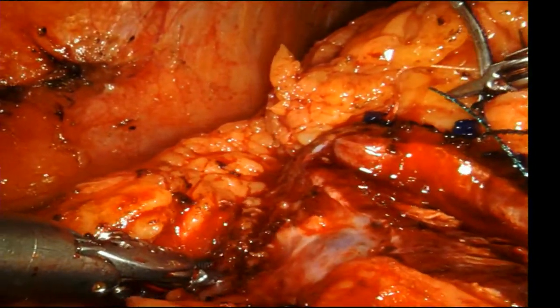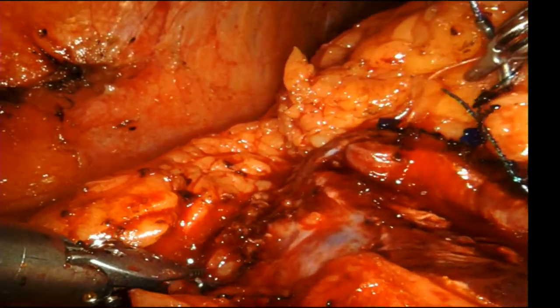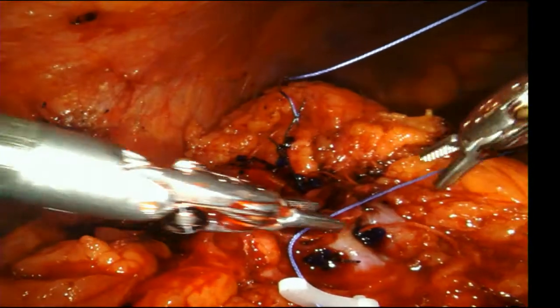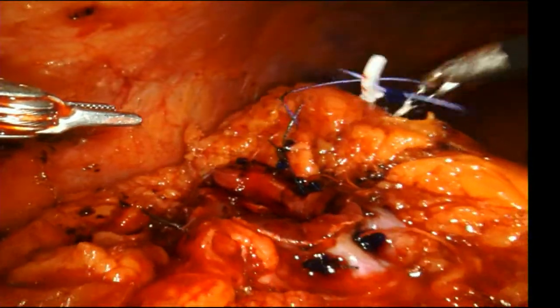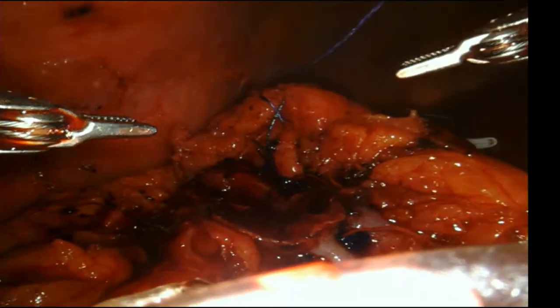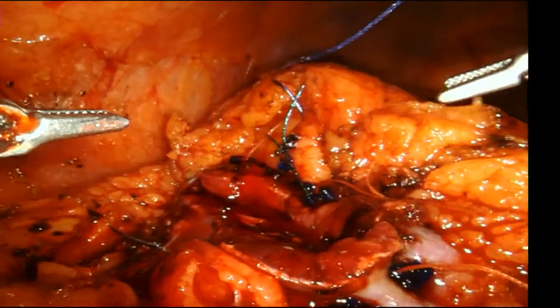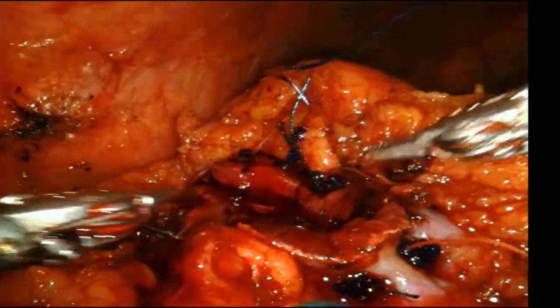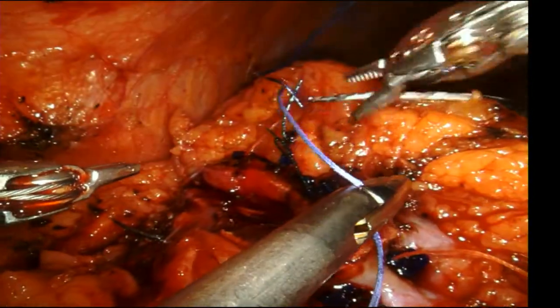Hey, Ronnie, you may have shown this at NARIS, this past year, or actually the year prior, I believe. Yeah, people either love it or they hate it. But basically, you just got to get over the idea of using these big needles. The final result is that this entire area is just going to be squeezed and you're not going to have to worry about bleeding afterwards.